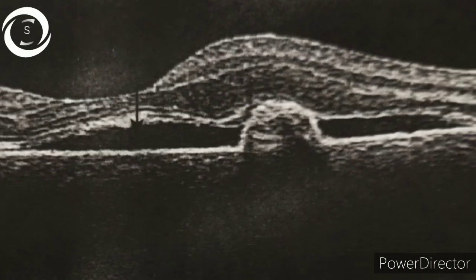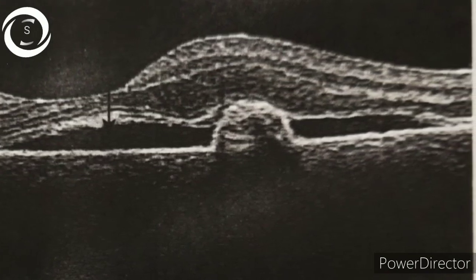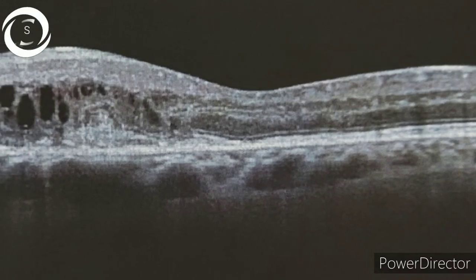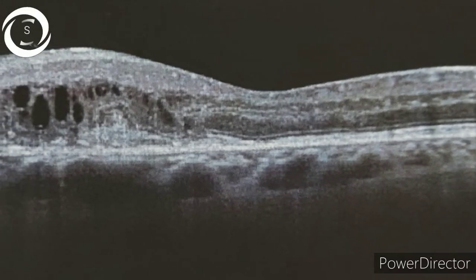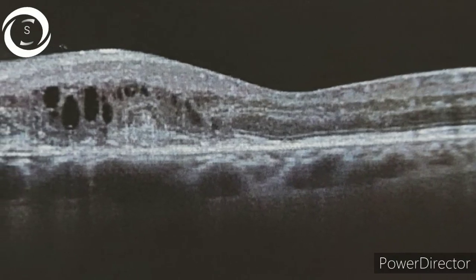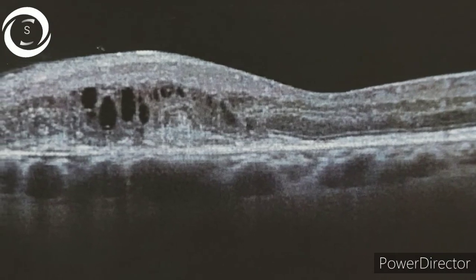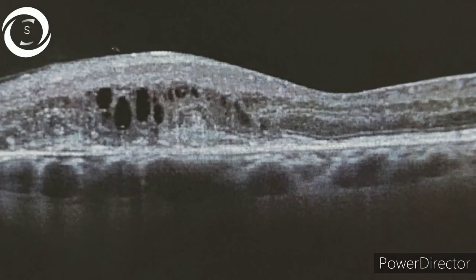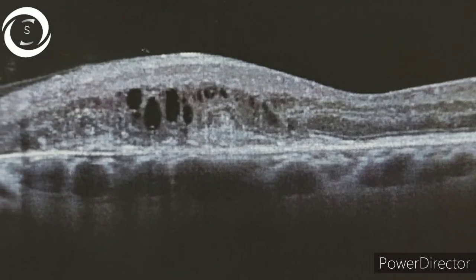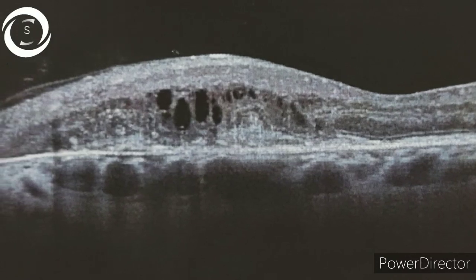Since the CNV is present above Bruch's membrane but below the RPE, that makes it type 1. In the third OCT, there is a dome-shaped elevation of the retina with loss of foveal depression, hypo-reflective intra-retinal fluid-filled cysts, and sub-retinal hyper-reflective material located above the split RPE. This is type 2 choroidal neovascularization, being present above the RPE and below the sensory retina.